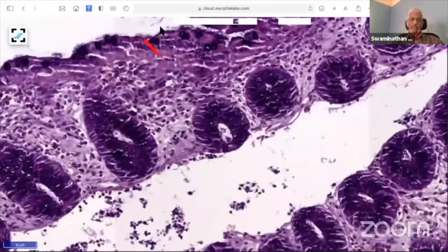Can you all see fuzzy material? It's like cilia or microvilli. When you see them, you have to think of microorganisms sticking to the surface. And this is a nice case of spirochetes. When you do a silver stain or IHC, you can very nicely see the organisms.